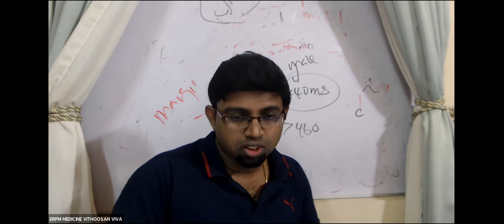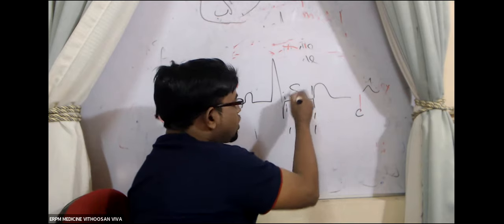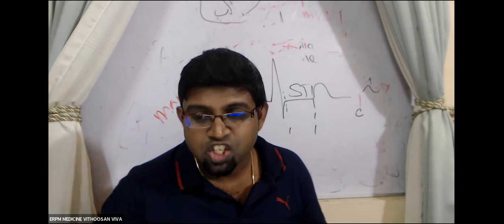Let me look here. Can you see here? This is my last point to finish on this one. Look here, guys. This part, this part. This we call the ST segment. ST segment.